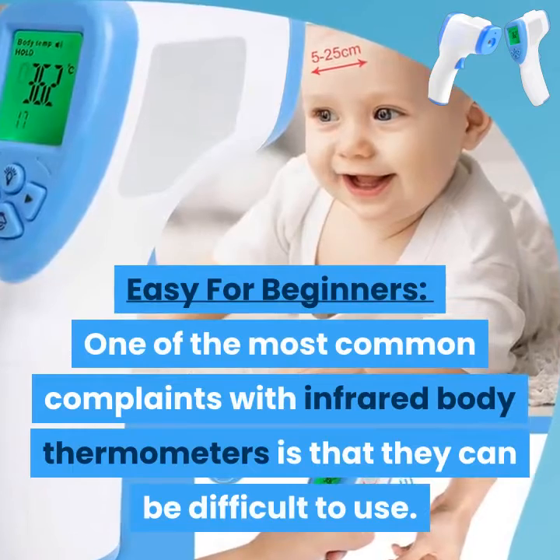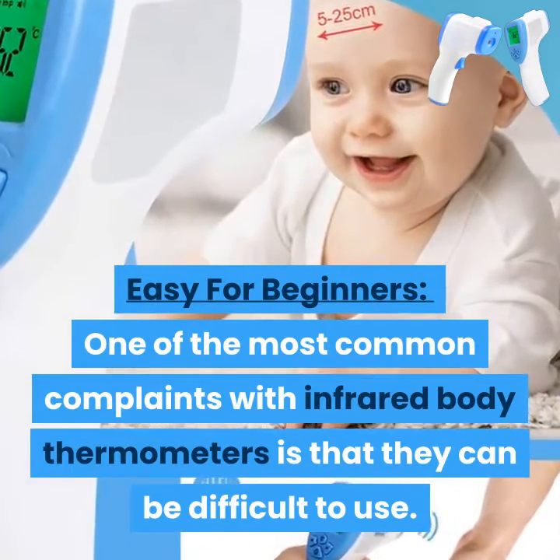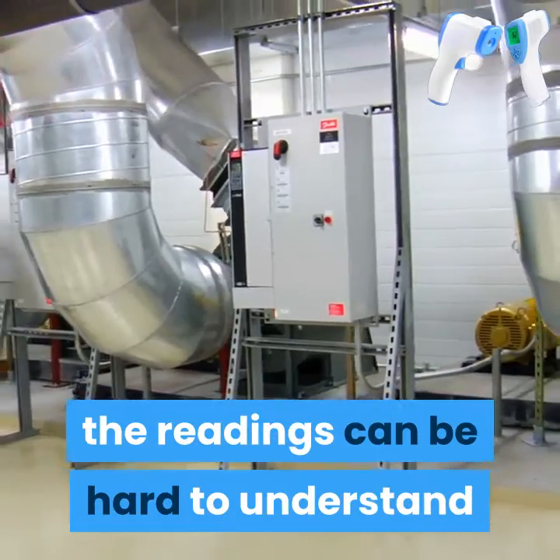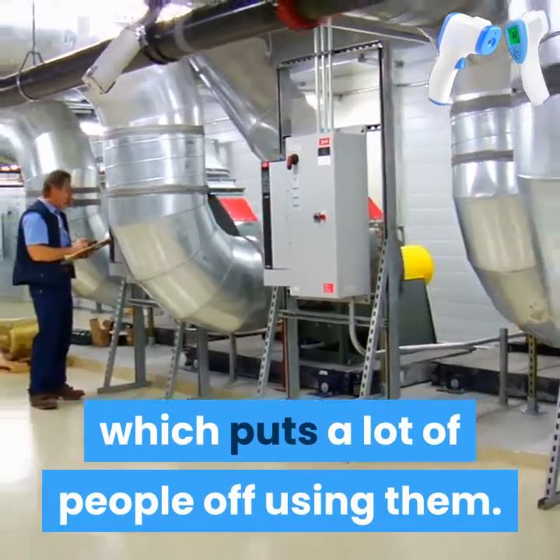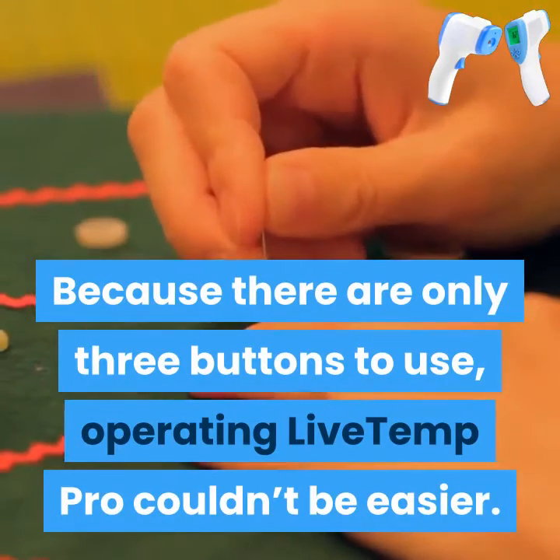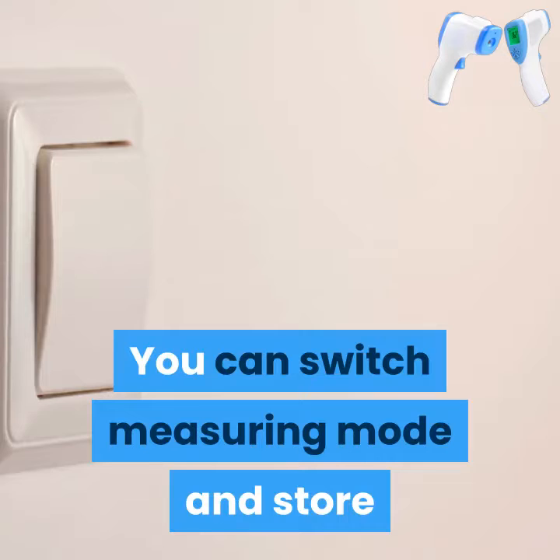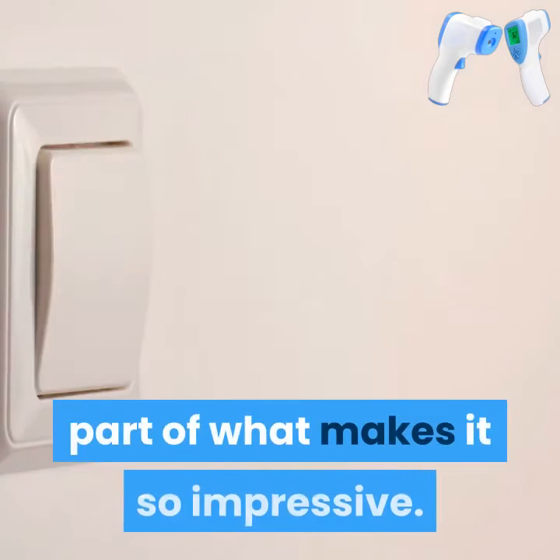Easy for beginners. One of the most common complaints with infrared body thermometers is that they can be difficult to use. Even after you think you've got it to work, the readings can be hard to understand, which puts a lot of people off using them. Because there are only three buttons to use, operating Live Temp Pro couldn't be easier. You can switch measuring mode and store and check the memory of the device, and the simple operation is part of what makes it so impressive.